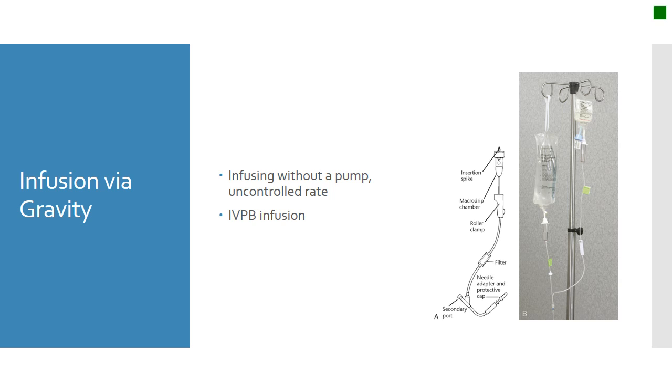Even though this could be hooked up to a pump, the pump will not know that it is delivering 2 different medications at different periods of time, but the higher medication will always be infused first. The lower medication will wait its turn.